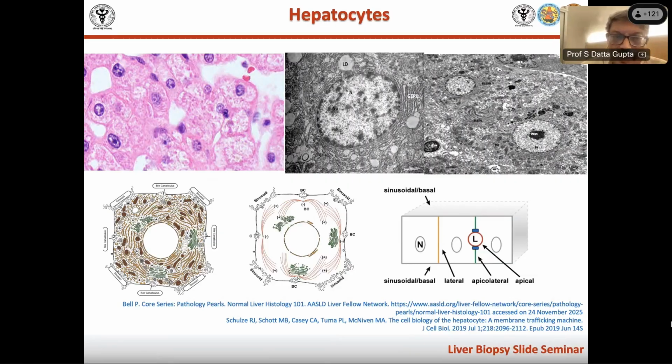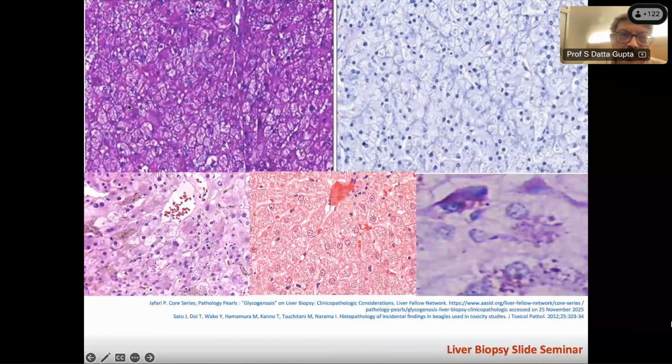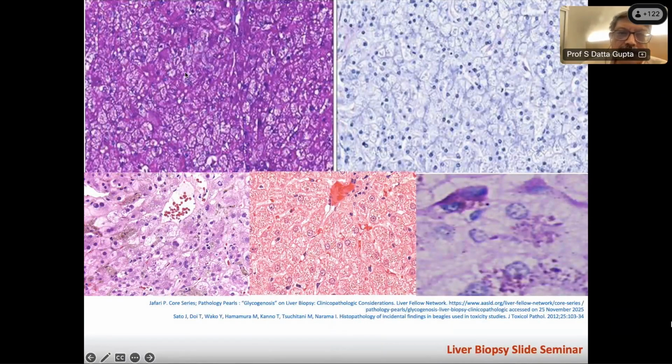There's a nucleus with a nucleolus, and chromatin is prominent in most of them. Most of the cytoplasm is slightly rarefied and granular. This is how you identify. Find a membrane which is very thin, and we'll see this. If you do a PAS stain, they'll be rich in glycogen, and this is with diastase.